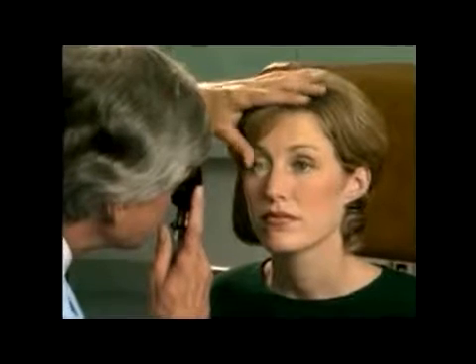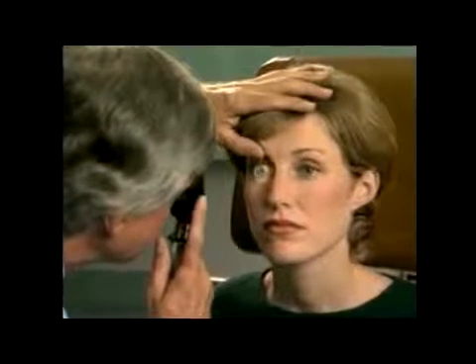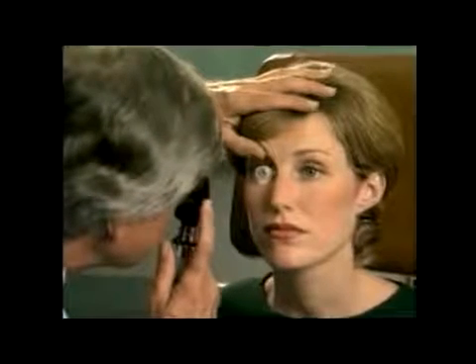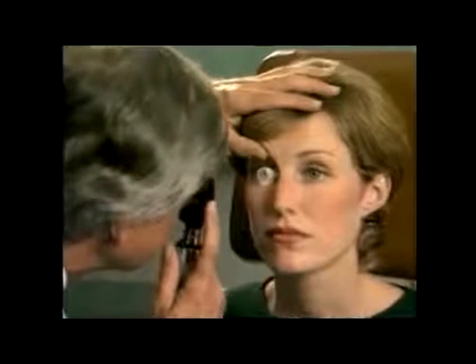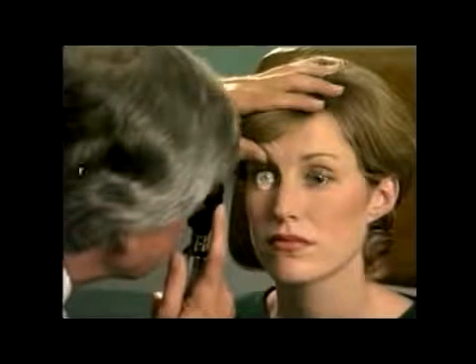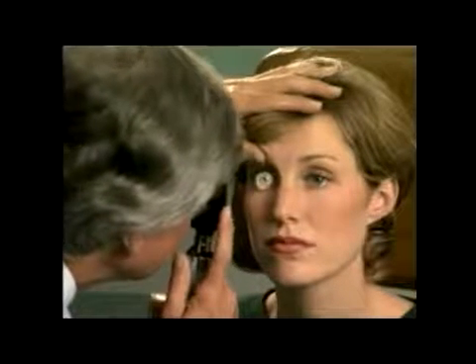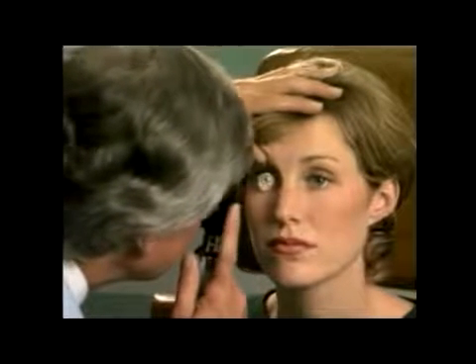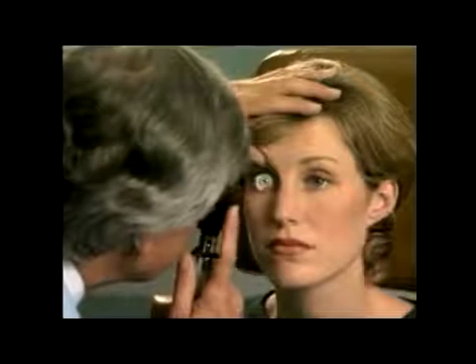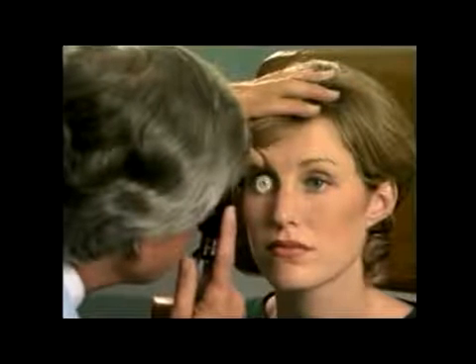Rest your left hand on the patient's forehead and hold the upper lid of the eye near the eyelashes with your thumb. Keep the reflex in view as you slowly move toward the patient. The optic disc should come into view when you are about 2 inches away.